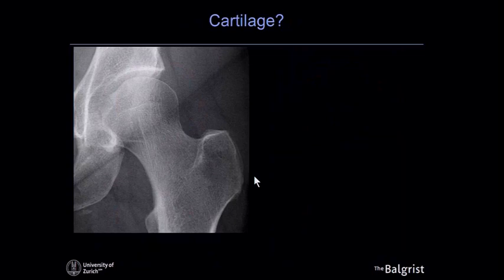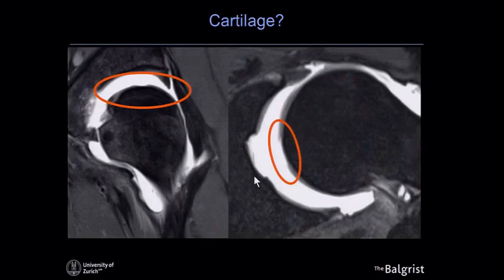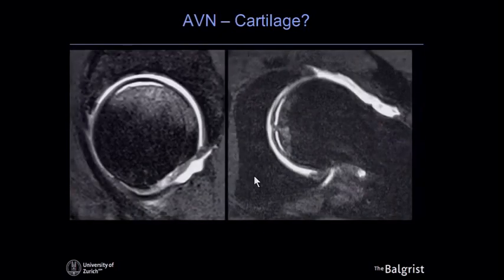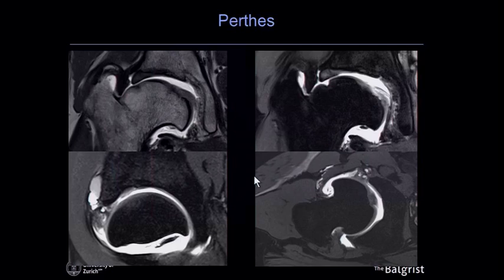Here a female patient with hip pain: the radiograph looks quite unremarkable, but on the traction MR a large defect on the femoral head is seen on the proton density image, and on the axial oblique image a full-thickness defect of the acetabular cartilage is clearly demonstrated. Another case with avascular necrosis shows a very large delamination with subchondral bone in the AVN area, seen in both sagittal and axial planes. A post-Perthes case with extensive femoral head deformity also demonstrates excellent cartilage analysis with traction arthrography.